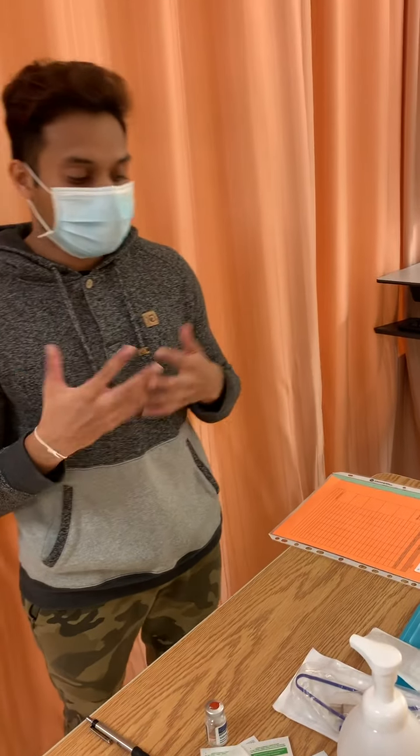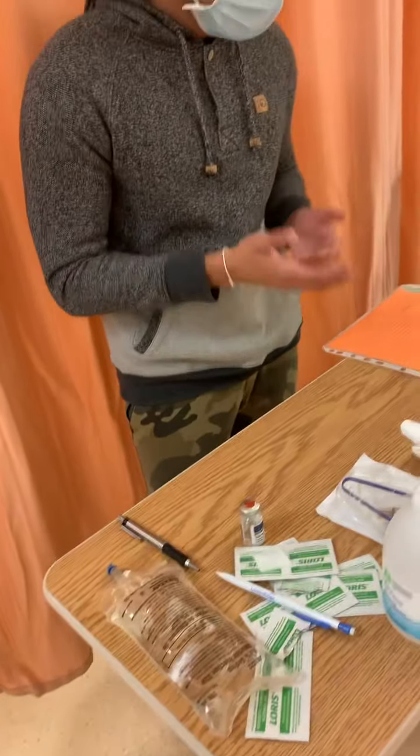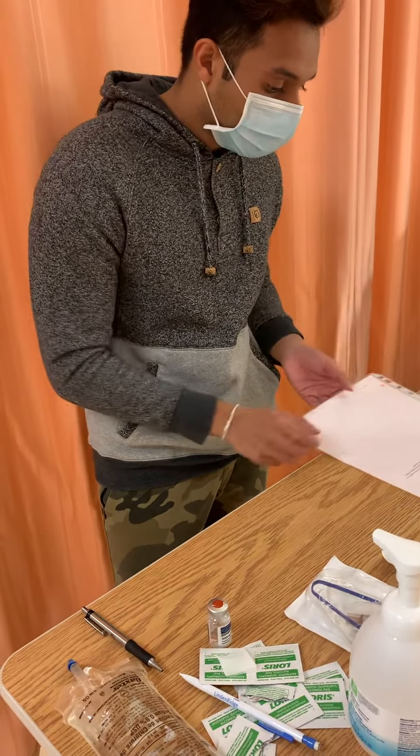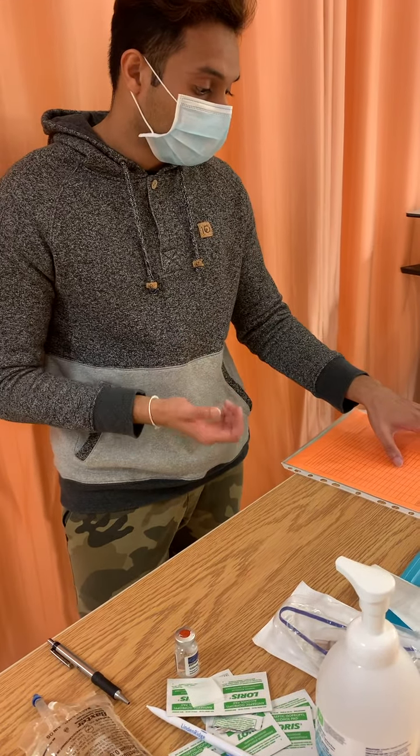I'm a student nurse at the University of Manitoba. Today we're going to be demonstrating IV mini bag insertion. So we have a patient here. His name is Watson William. We saw he was admitted for cellulitis, so we're going to be treating that. We're just going to wash our hands, and we know that he's allergic to shellfish, so that's good.